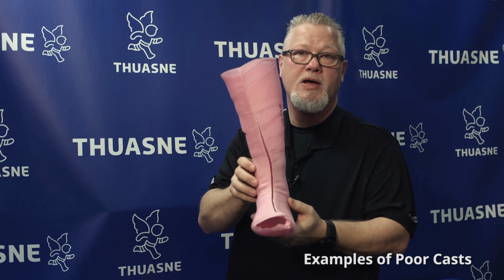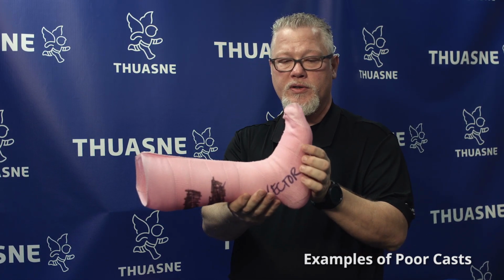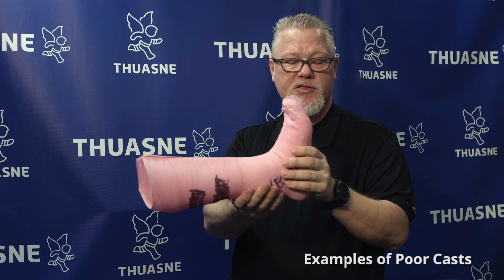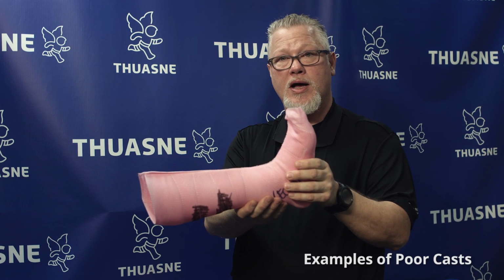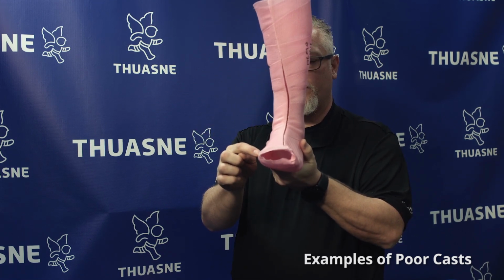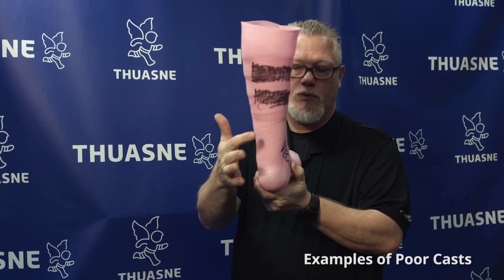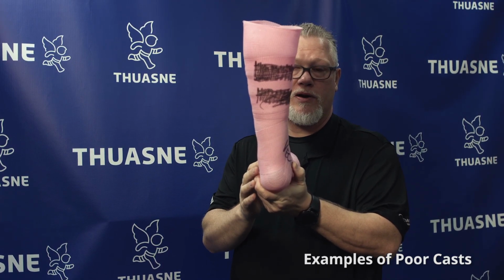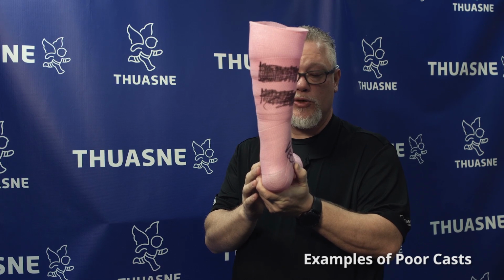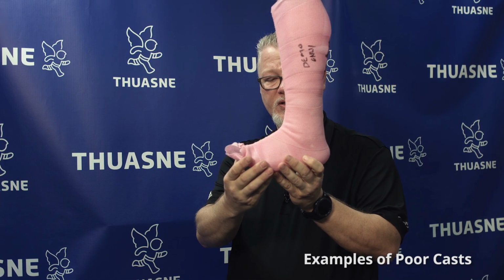When we grab the left, the foot is not symmetrical to the right foot. So if we hold it in this direction, there's a significant amount of toe extension, which is going to present a challenge in modification. We do have the forefoot supination, but if you look there, we've now incurred a little bit of hind foot varum, so that's going to be an issue as well. And this cast is also dorsiflexed as well.